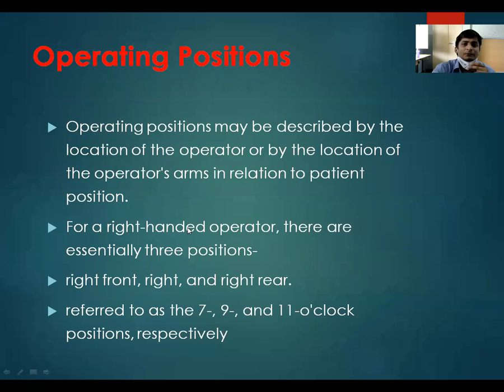Coming on to the operating positions. Operating positions may be described by the location of the operator or by the location of the operator's arm in relation to the patient position, depending upon the operator and the chair or patient position. For a right-handed operator, there are essentially three positions. These are the three commonly used positions in dentistry.